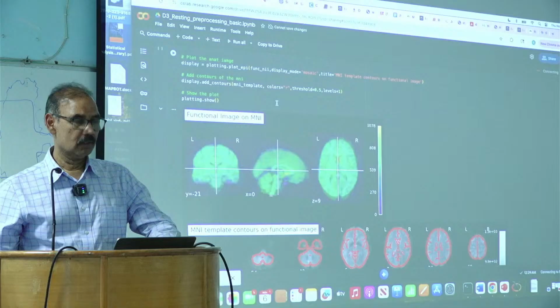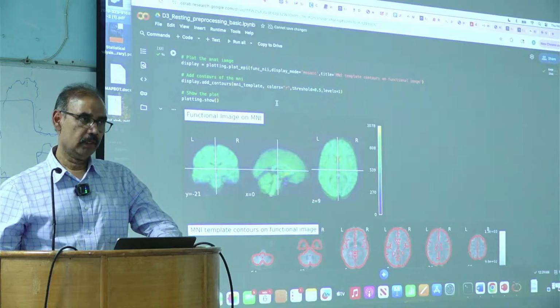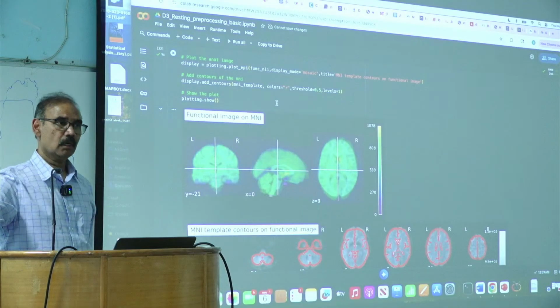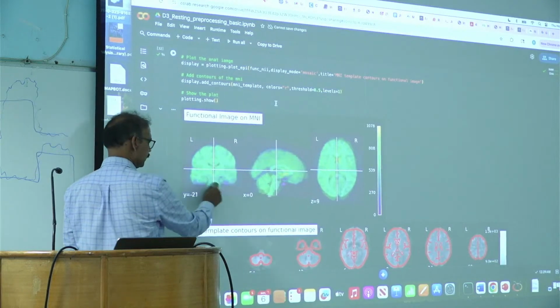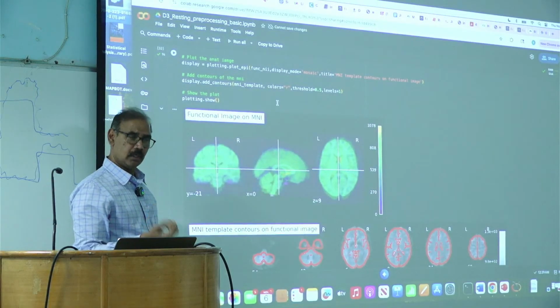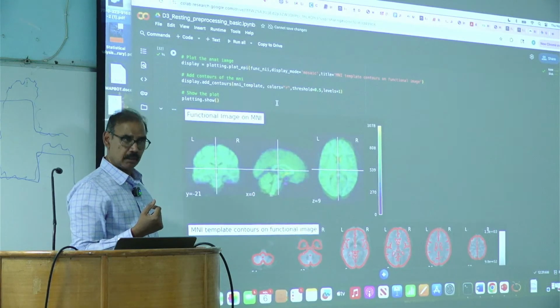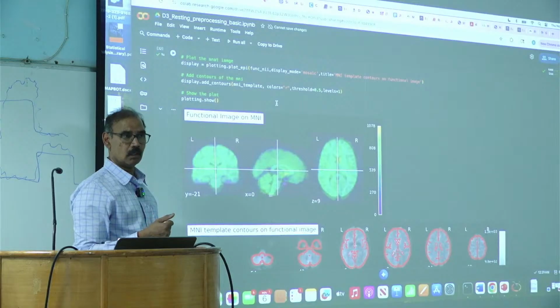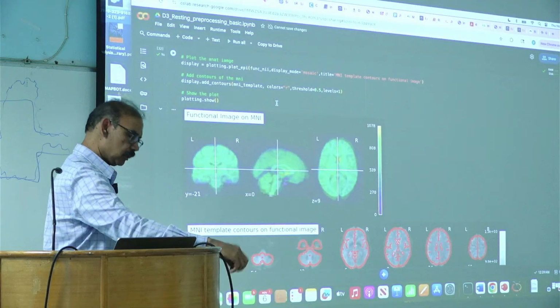So I was expecting that I have some image, and from the image I enter this mask. I have the image and I have the mask. So I need to match the image with the mask so that I can extract this time series. But in that code, we only load the mask. So my question was just confused: how from the mask are we going to extract this time series?